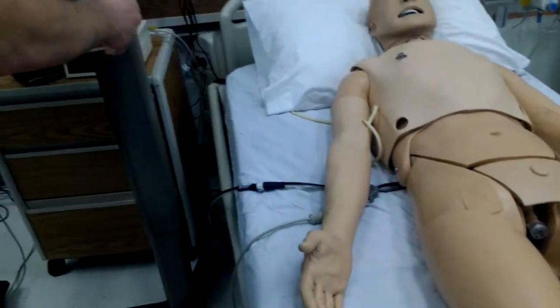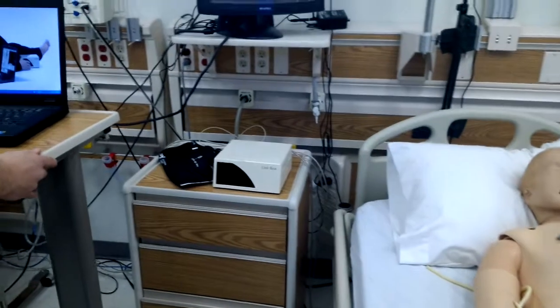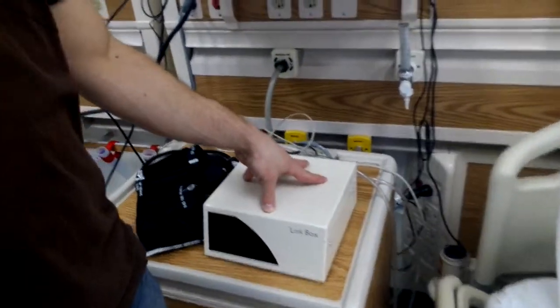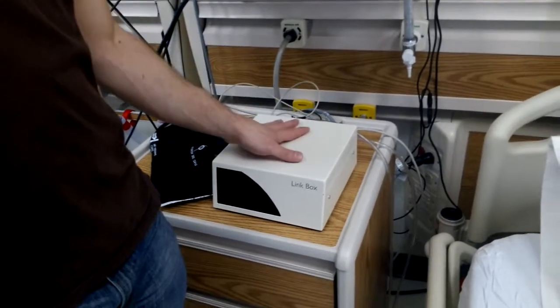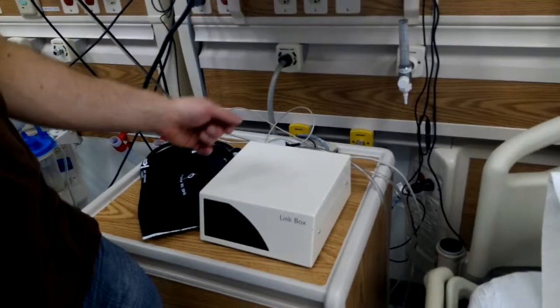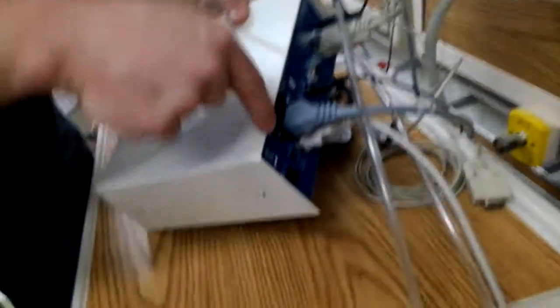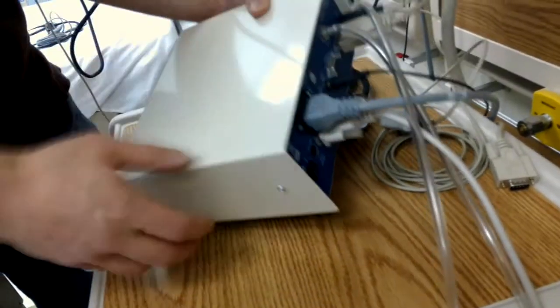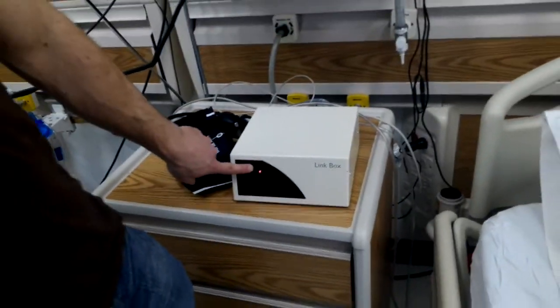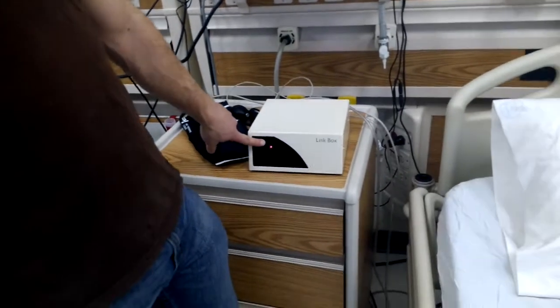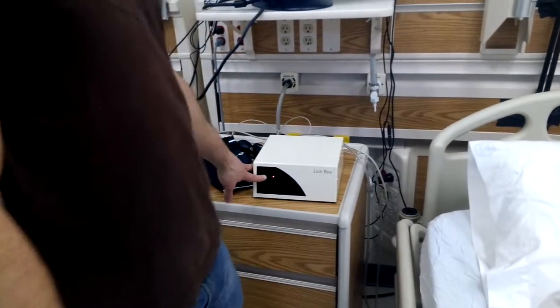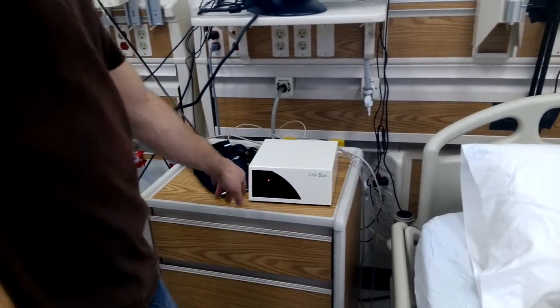Where does that come from? Back here, we have the link box. The link box translates all the commands from the control laptop to the SimMan. So we have to turn the link box on. There's a switch back here. Flip it. And we will see a flashing red light on the link box. What that means is the link box is on, it has power, but it is not receiving any information from the laptop as of yet.